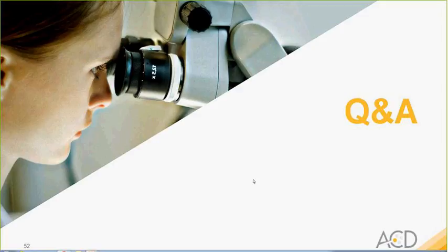Another question is as follows. Is it possible to combine the RNAscope technique with IHC staining, for example, with a cell marker, potentially a cell surface marker? The answer is yes.